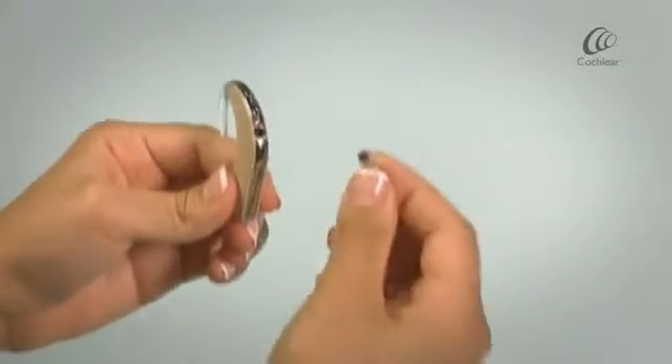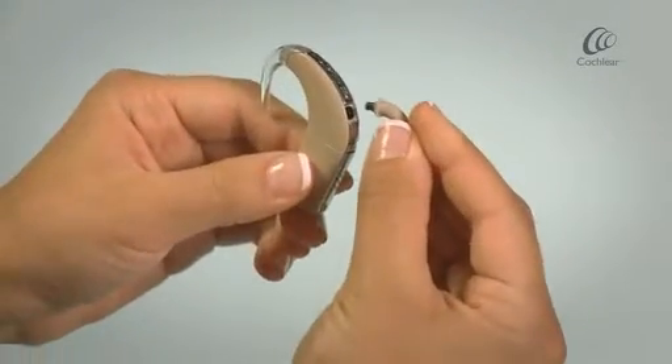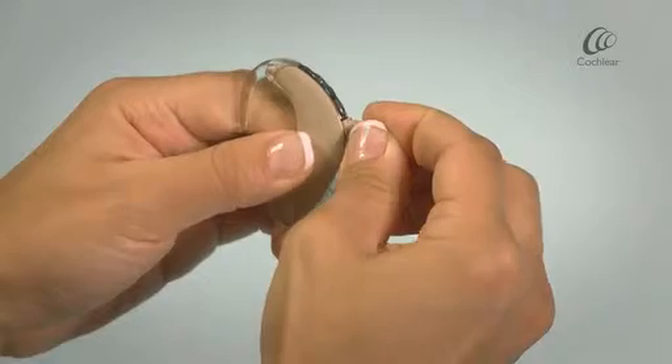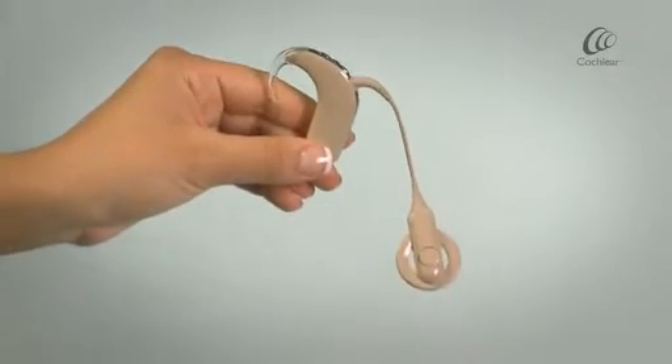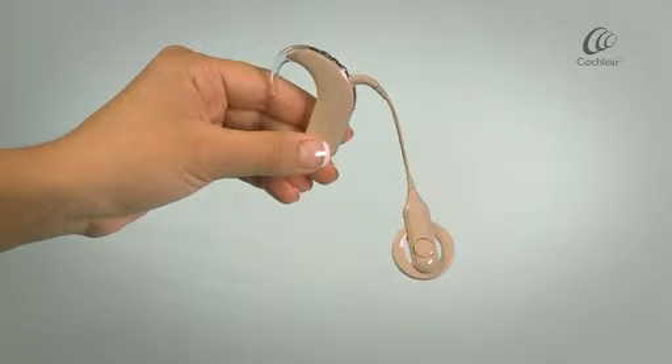Attach the coil cable to the processor. And you're now ready to use your sound processor.